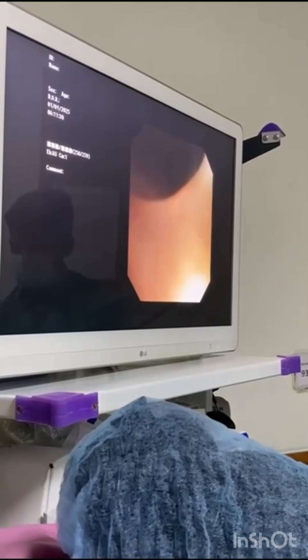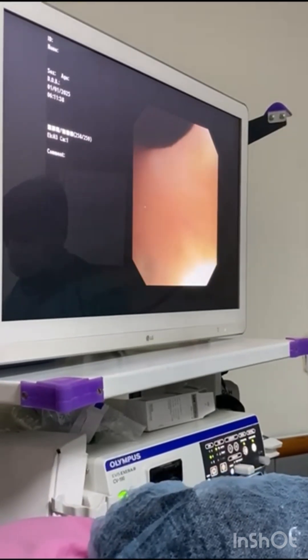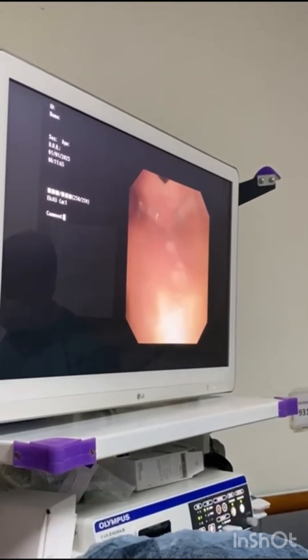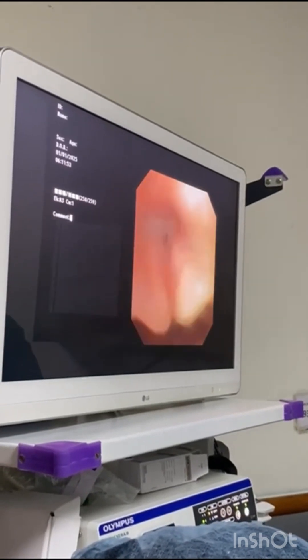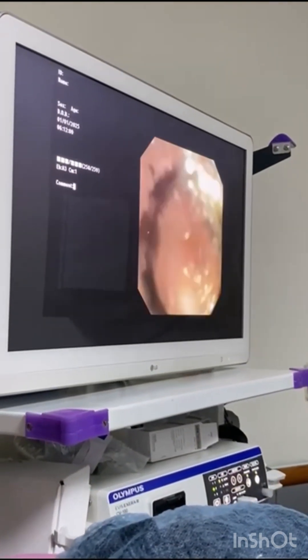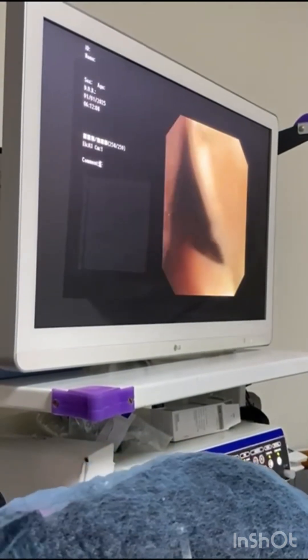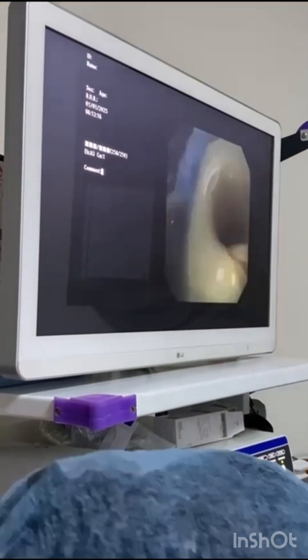On the screen it is visible whether the glottis is normal or abnormal. There is laxity of muscles and laxity of cartilage. Now the vocal cords are coming into the picture — the right vocal cord and the left vocal cord. The left vocal cord is clear but the right vocal cord is not as clear, as the laryngomalacia portion is covering the right glottis. The diagnosis is now clear: omega-shaped epiglottis with laxity of arytenoid cartilage — this is laryngomalacia.